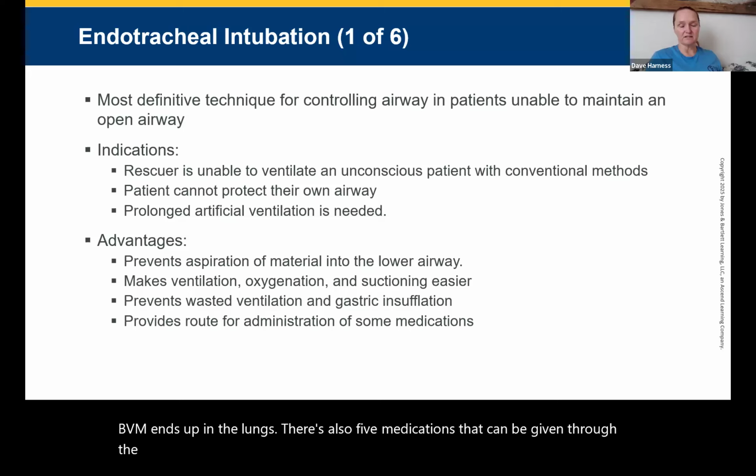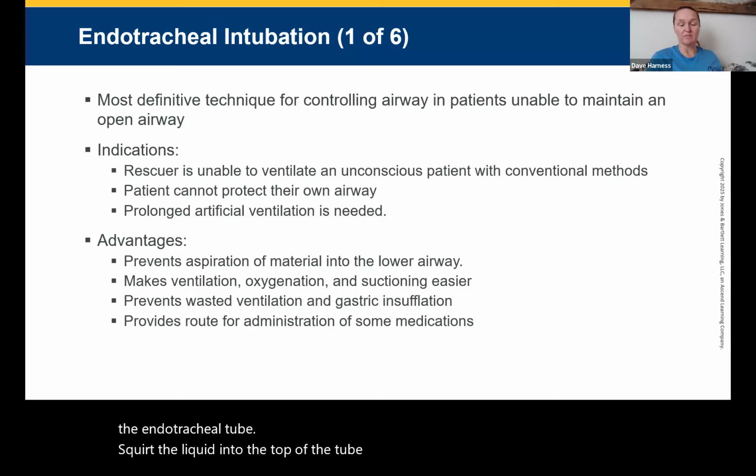You squirt the liquid into the top of the tube, and then you provide breaths with the BVM, and that disperses it into the lungs where it's absorbed.